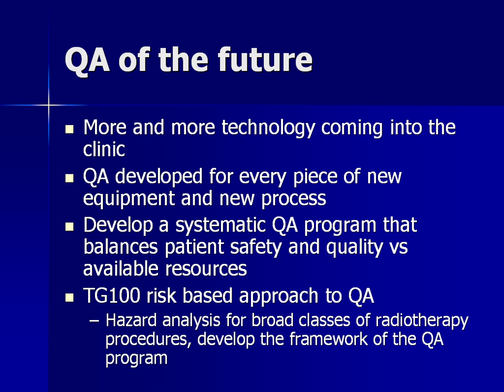So we've run into a problem. There's more and more technology that's coming into the clinic, and we just really, frankly, don't have time to do all the QA. And what happens is, as more technology comes in, we keep adding QA tasks, and we don't drop any. So, including the simulator, as you can see.